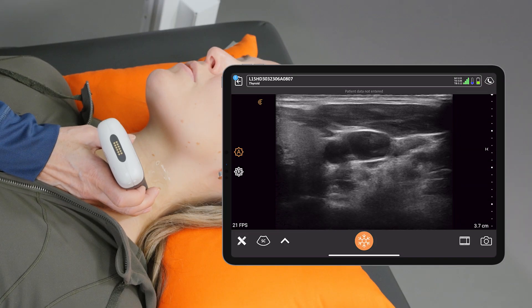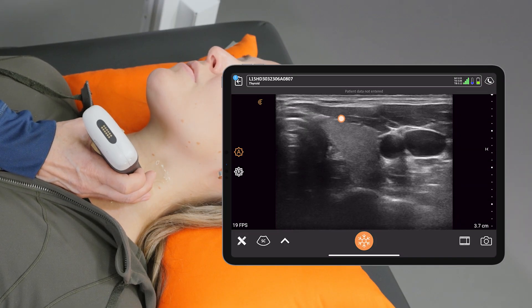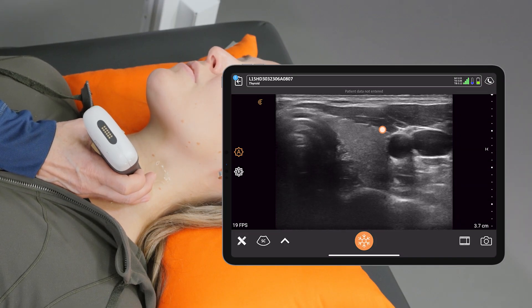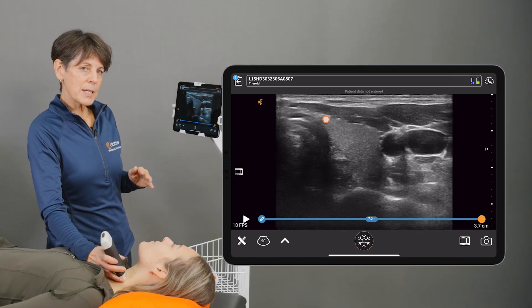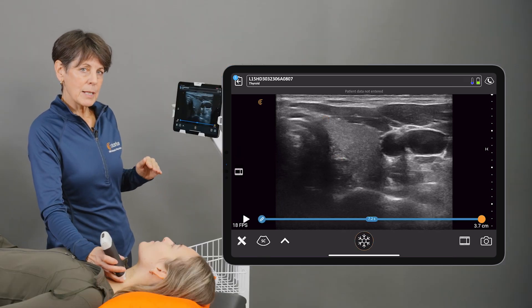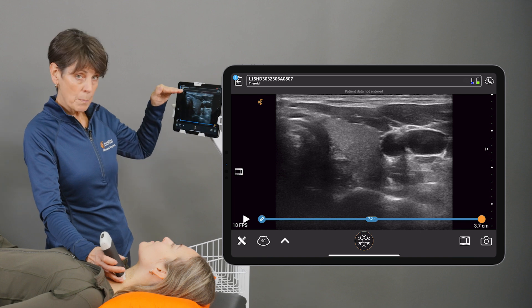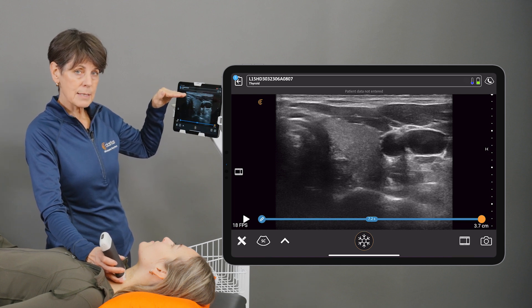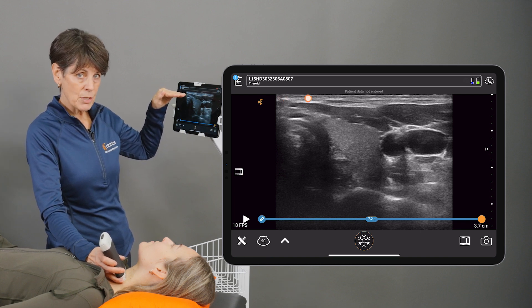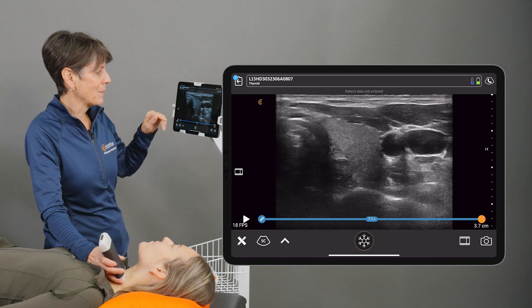I'm going to be imaging my model's thyroid gland just for reference here. We're in the thyroid preset and the first thing I want to talk about is the image from top to bottom. The top of the image is always the skin of the patient, or the structure that is the absolute closest to the scanner surface.